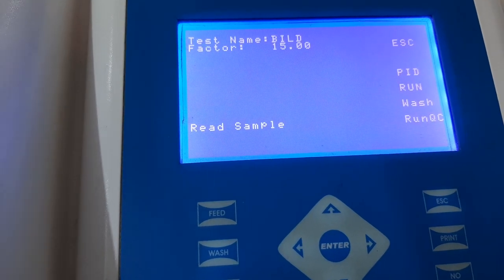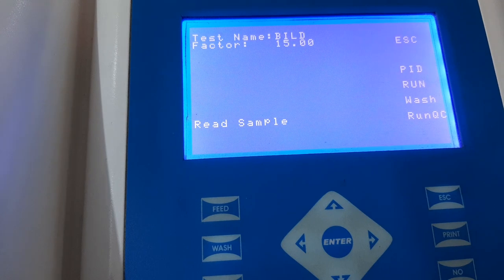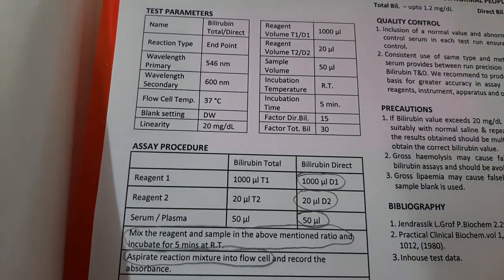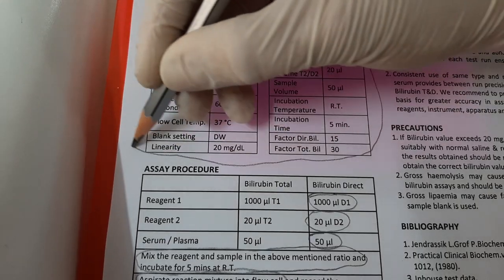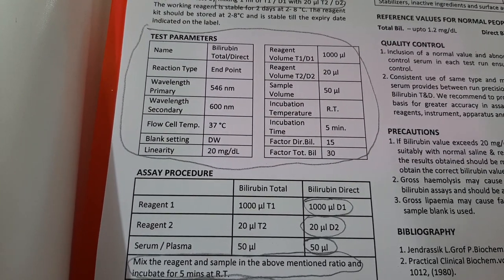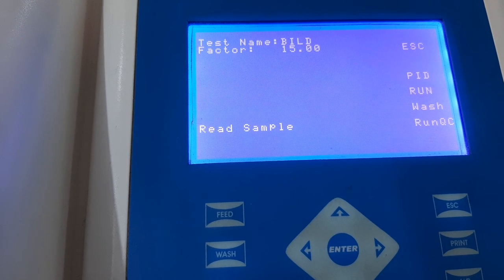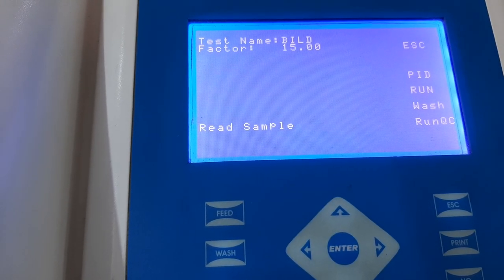Meanwhile, when the incubation is going on, open the program of bilirubin direct which is already pre-fitted into the instrument and keep it ready to read the sample. Please refer to a separate video in which we have explained clearly how to program the bilirubin direct kit in any semi-automated biochemistry analyzer using the parameters mentioned in the instructions for use. So in this program, we have already opened the program and kept it ready to read the sample after the incubation is complete.